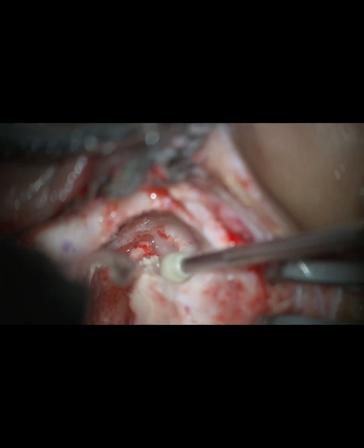Though we have broken a bridge, now we will plan for a canal wall reconstruction with tragal cartilage.